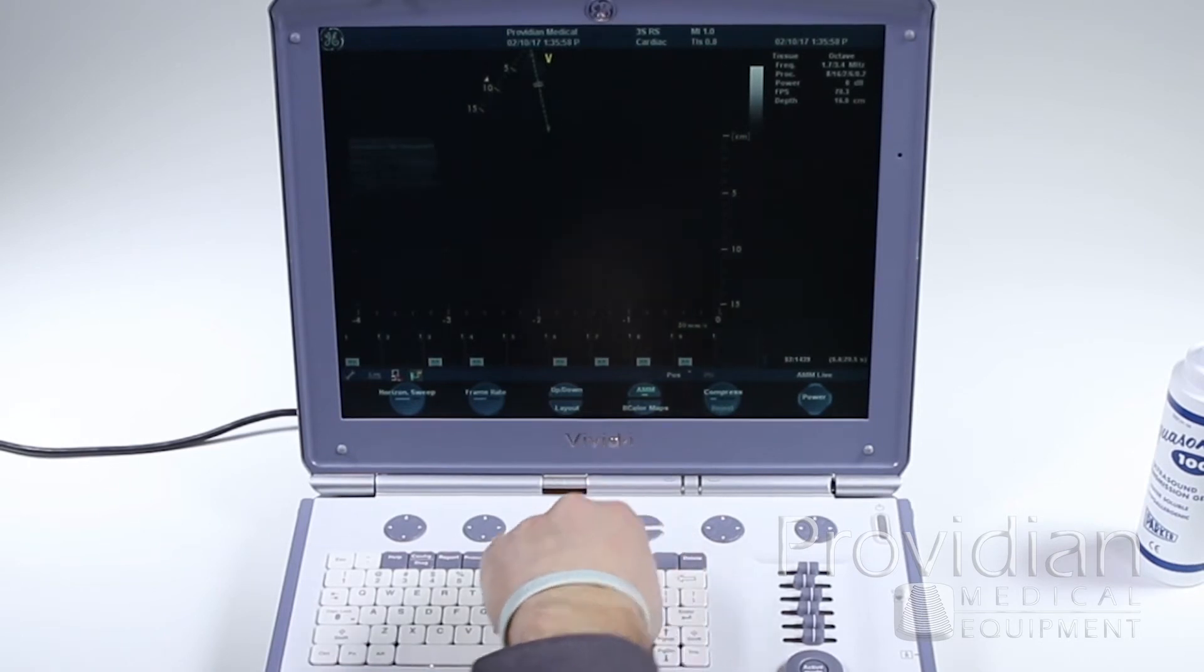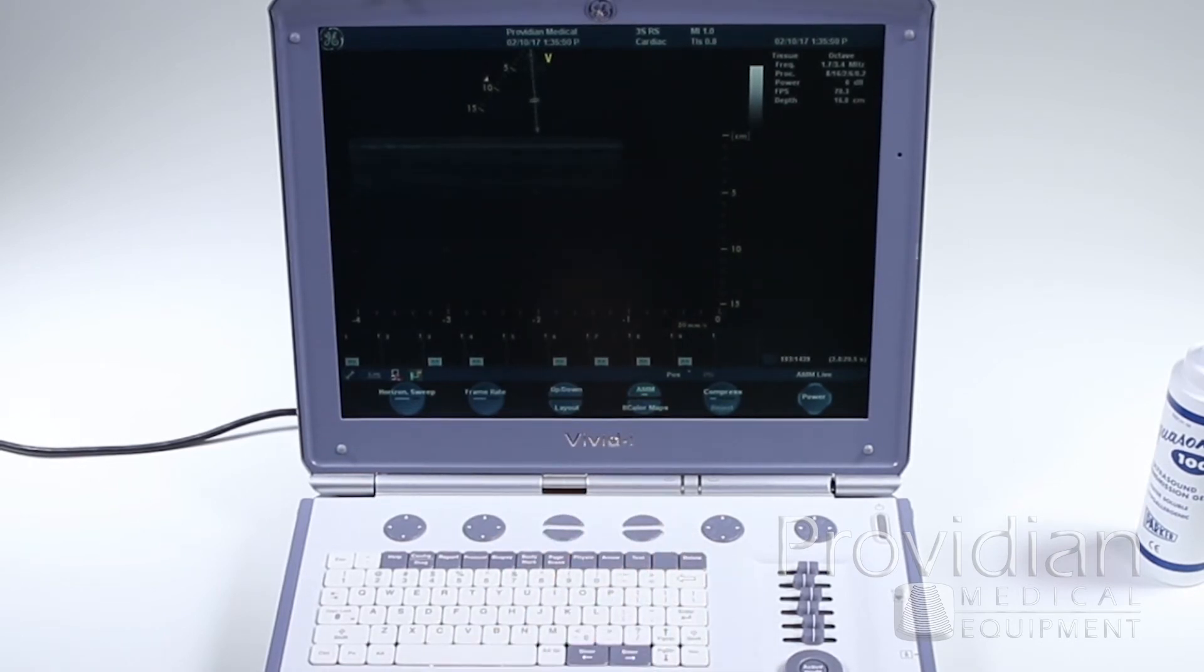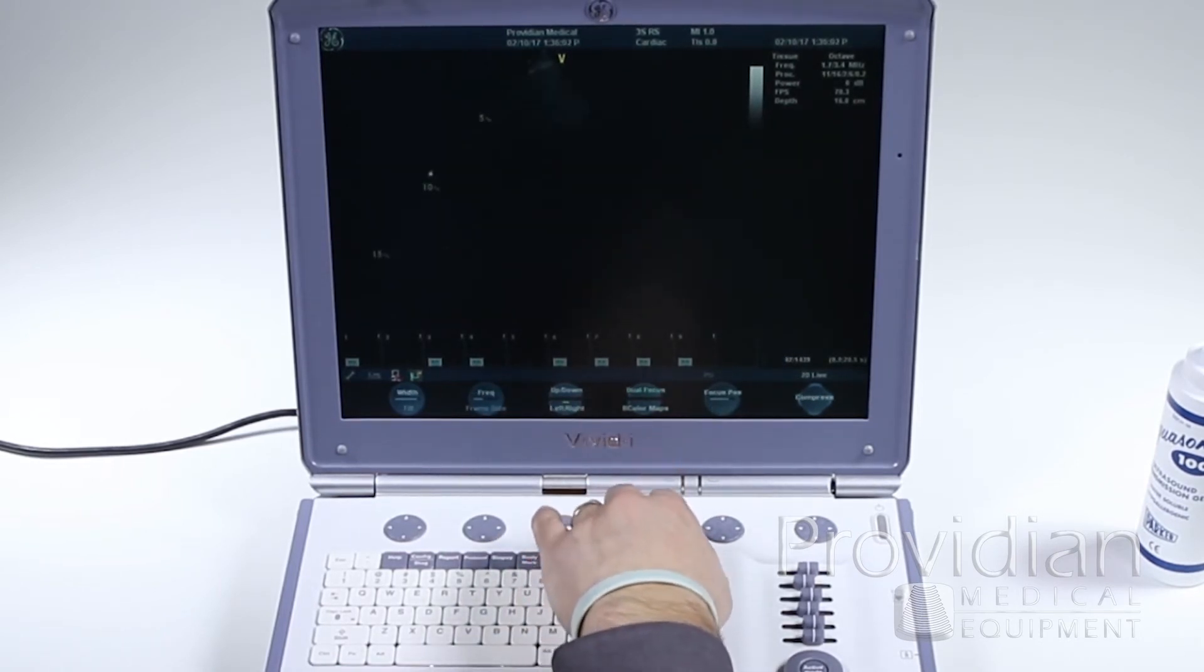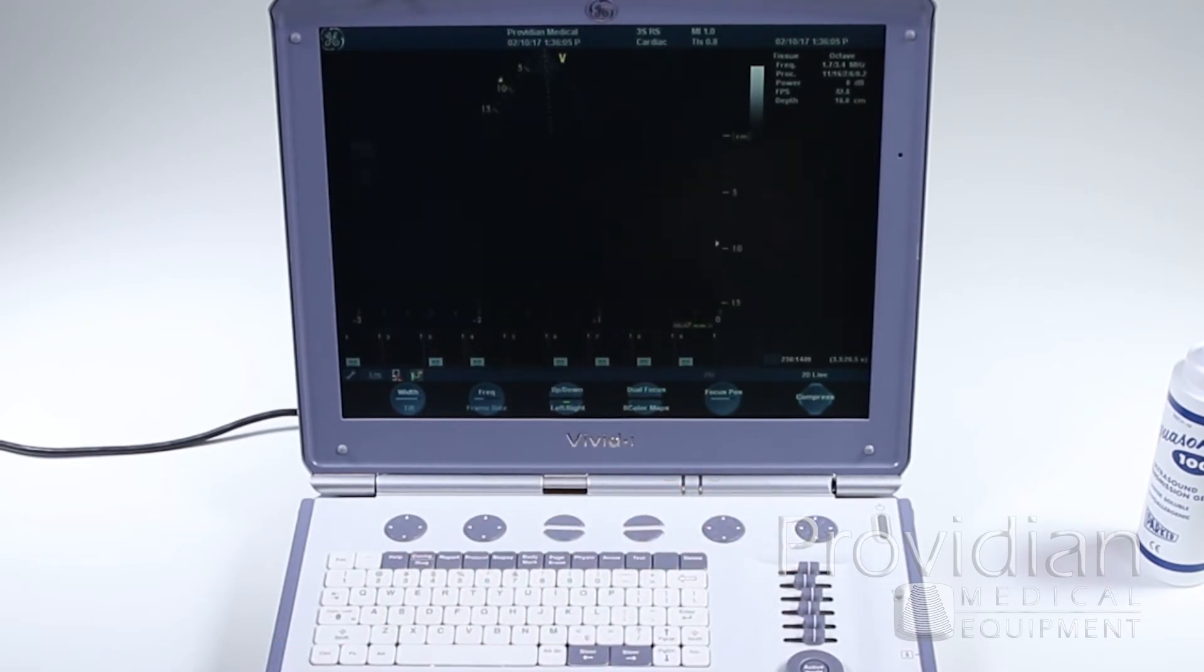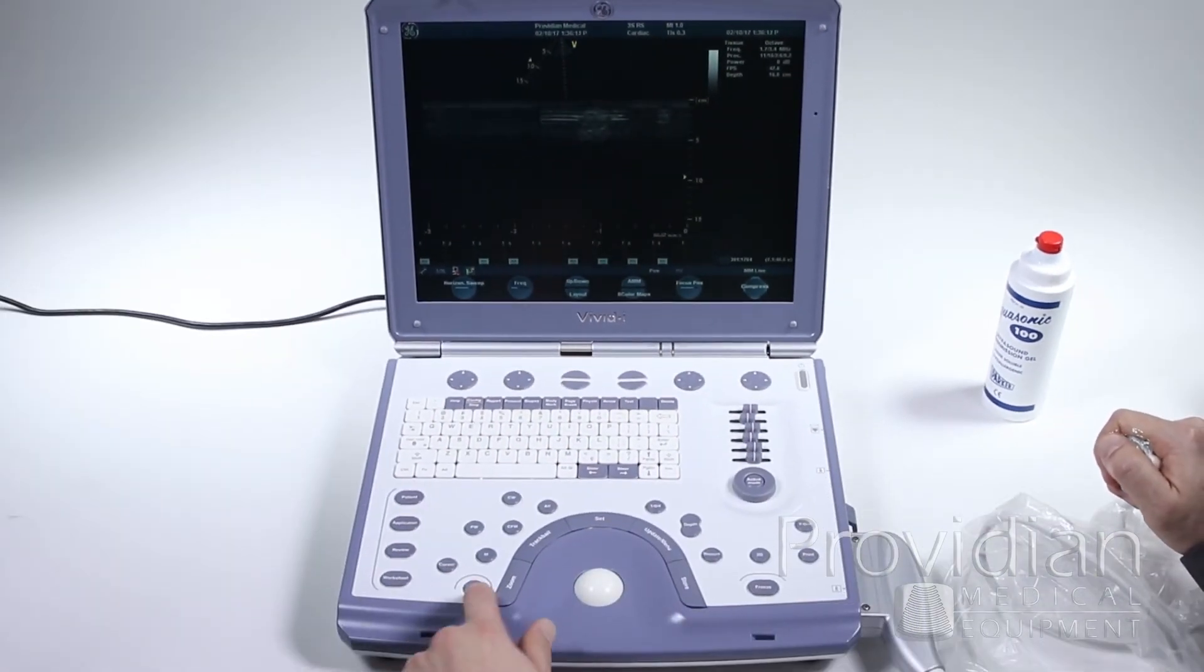Anatomical M-Mode is here. You can flip that on and get your new direction for the anatomical M-Mode. Color maps, focal position. Press 2D to go back.